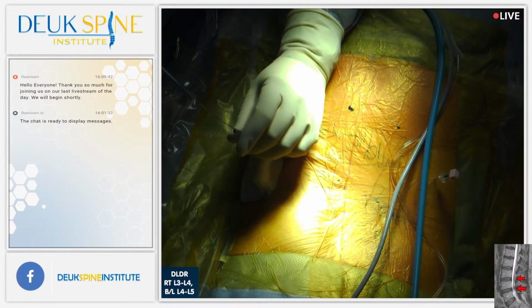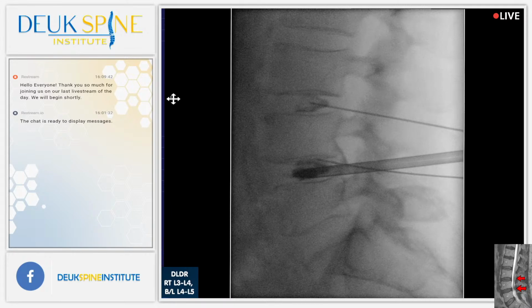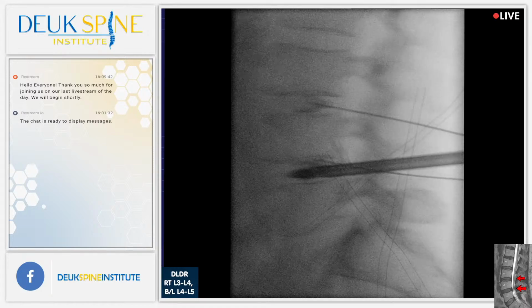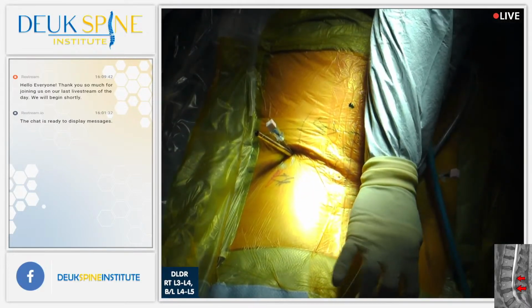Oh, now you can see the tear, the herniation better, right? You guys see that? For some reason the dye came out better now. Okay, now we're going to put a tube down, and we're going to do the entire endoscopic spine surgery through a small tube that's really an internal diameter of about 5.5 millimeters. There we go. That should be it. All right, remember, what's causing her pain in her back and down her leg is the annular tear and the herniation. Jordan, you want to take the fluoro out?